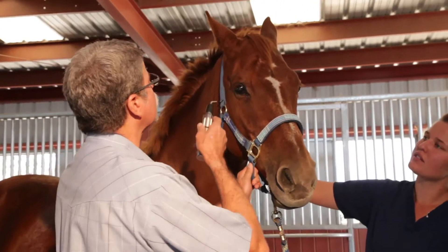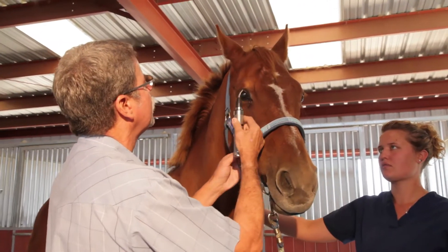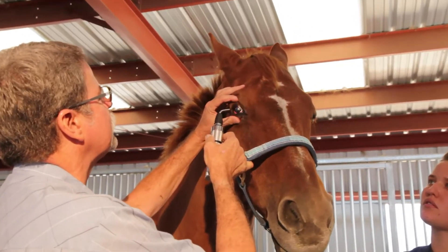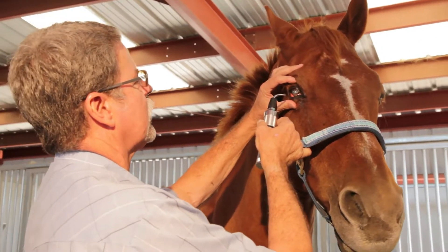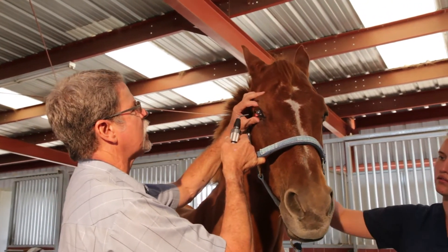There's an 18-year-old warmblood horse, and a couple weeks ago he sustained some uveitis, a flare. He's subsequently been on some atropine and anti-inflammatory meds and he's progressed quite satisfactorily. The atropine is starting to wear off because we do have some constriction of the pupil. The uveitis has subsided.